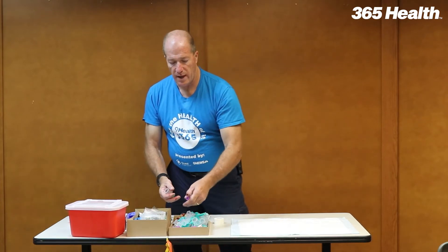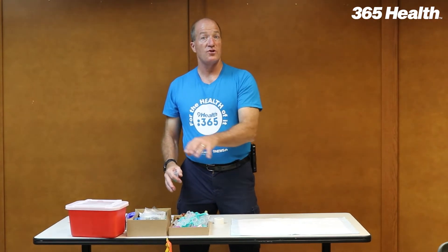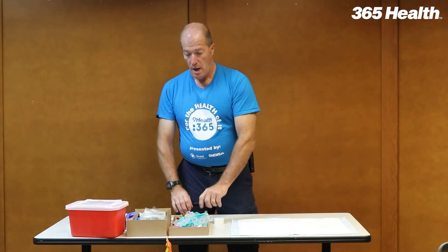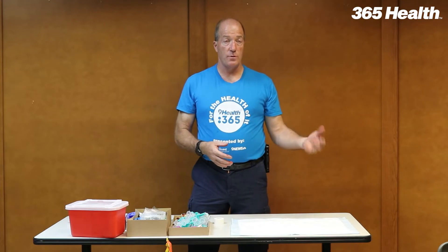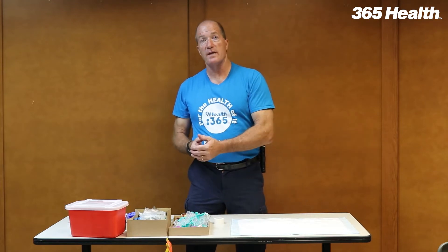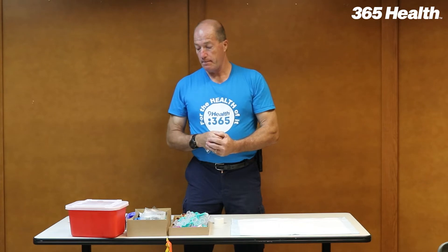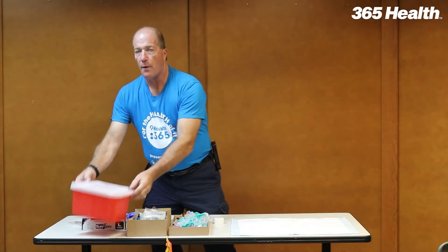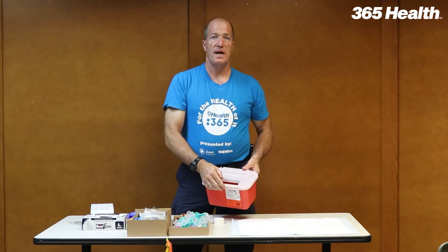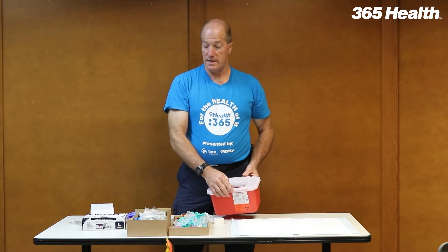I like to set them out so that I can reach out and touch everything in a box and share between people. This box is not meant to last the entire fair. The lab supervisor should be going by, checking on supplies and refilling supplies as needed. In addition to setting up your table, you're allowed one sharps container per phlebotomist — we do not share the sharps containers.